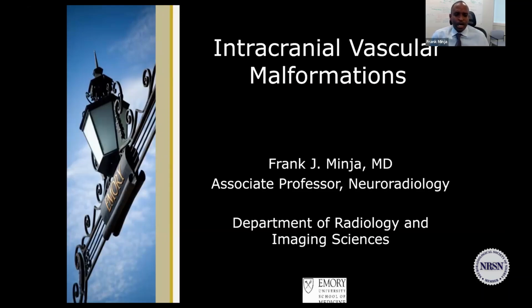And so many times when people read cases, when they're not sure whether or not they're dealing with a vascular malformation, they basically get very scared, or they don't really do a proper job in classifying. And hopefully we can demystify this topic by the end of this hour and give you multiple chances to participate in the management of these cases.